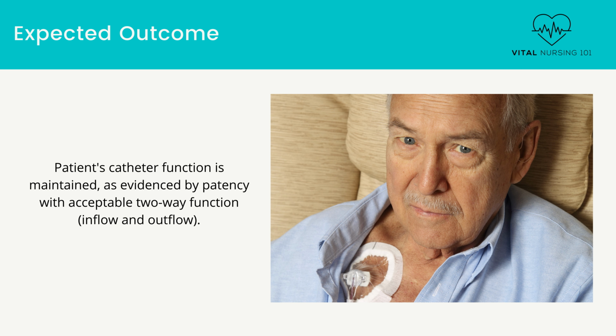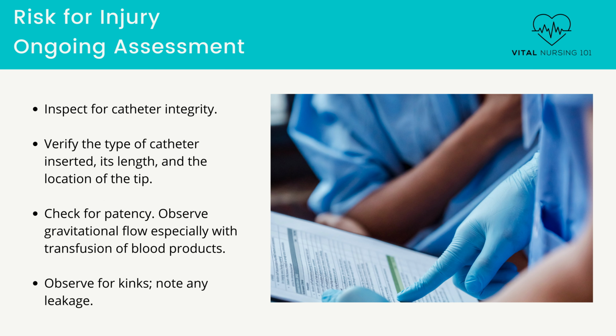As a nurse, here is the expected outcome we need to achieve. Patient's catheter function is maintained, as evidenced by patency with acceptable two-way function. As a nurse, we will need to assess the following. Inspect for catheter integrity. Early assessment facilitates prompt intervention and reduces complications.